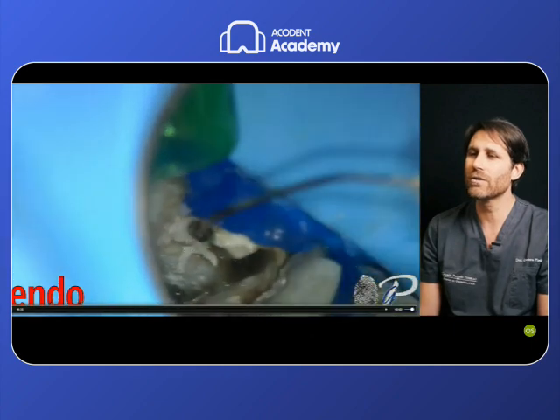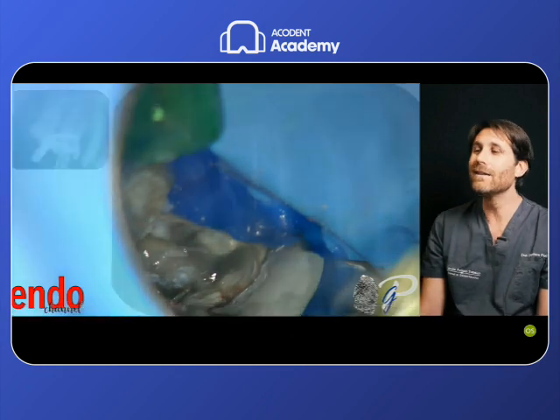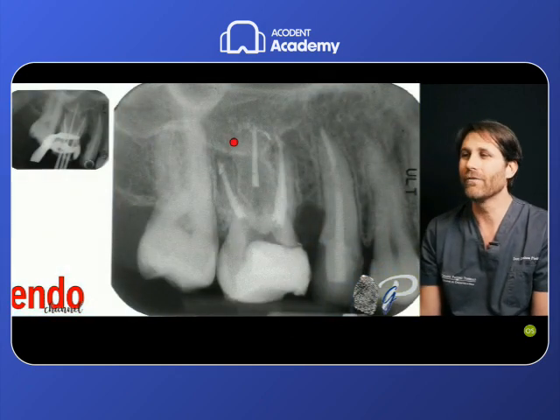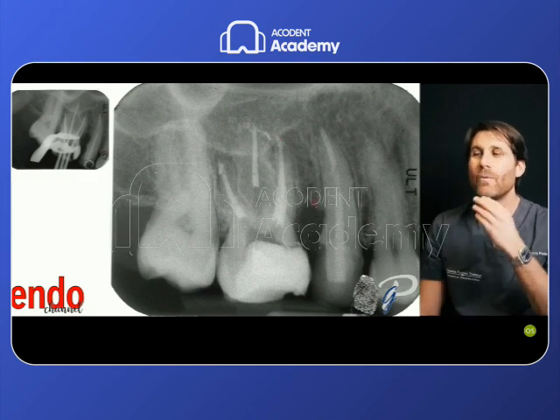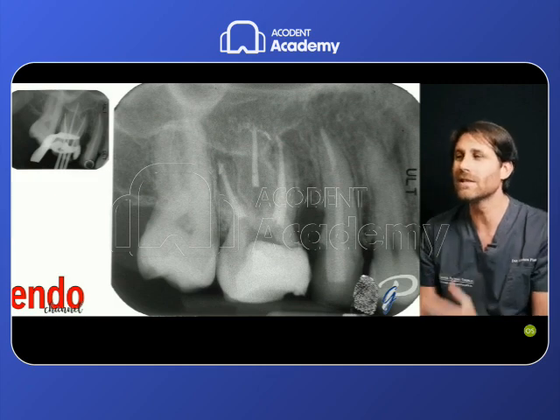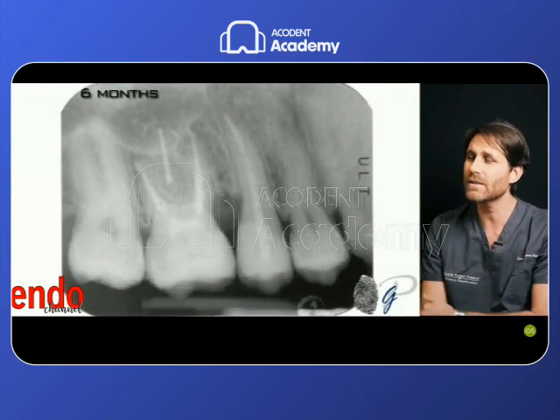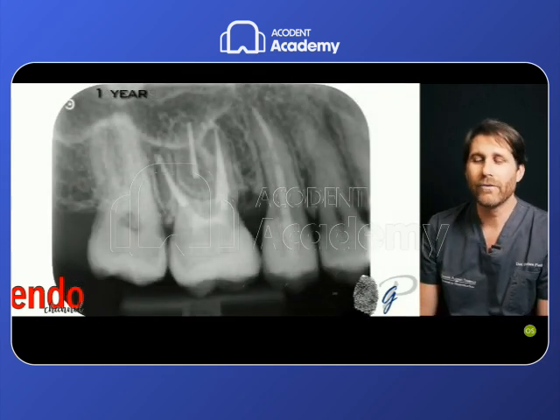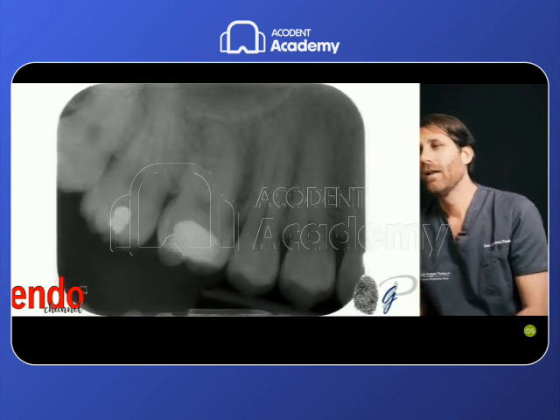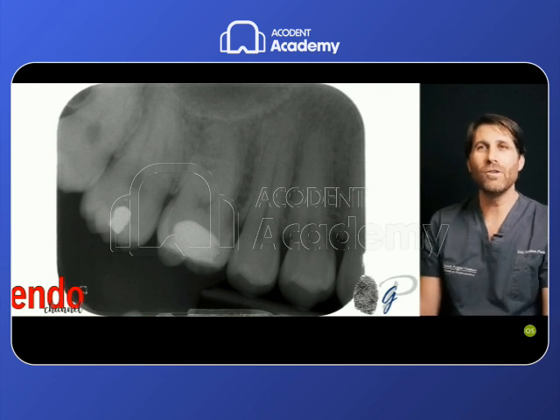So here we reached the working length after this very hard work on this root that is not explained by this radiograph. It seems a very simple mesiobuccal root with 2 root canals, but it's quite straight. So we cannot appreciate how difficult this case was, with probably curvature on other planes rather than what we see on the radiograph. And those are the controls after the restorations and after 1 year. So this is the case solved with this approach.